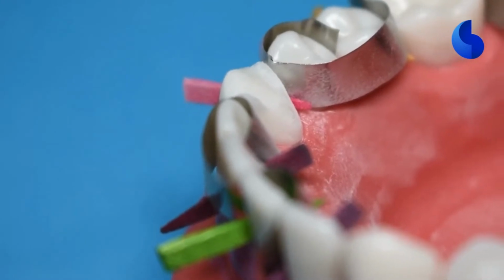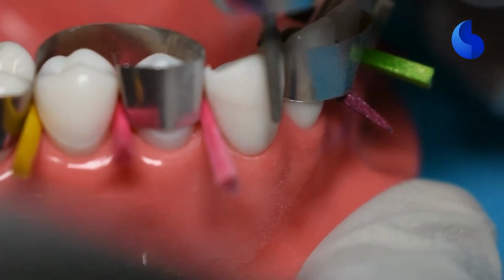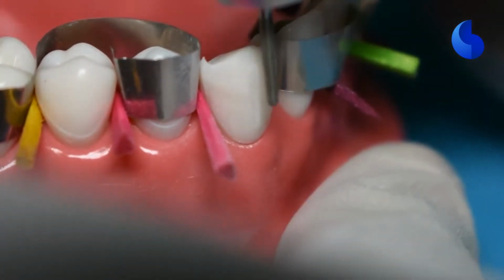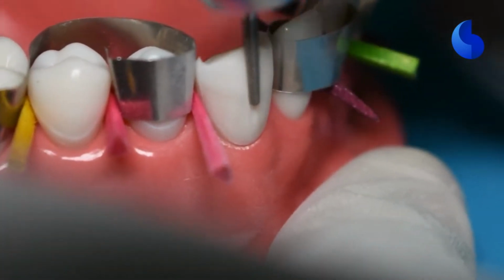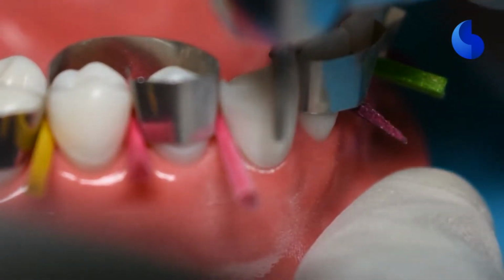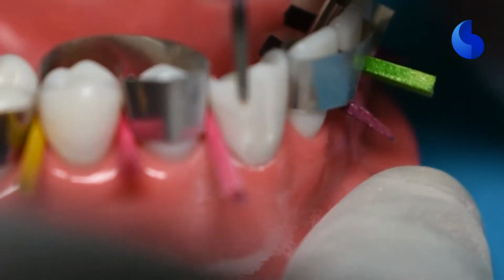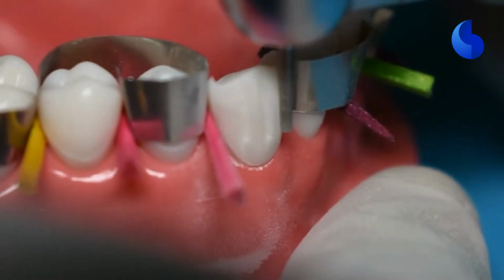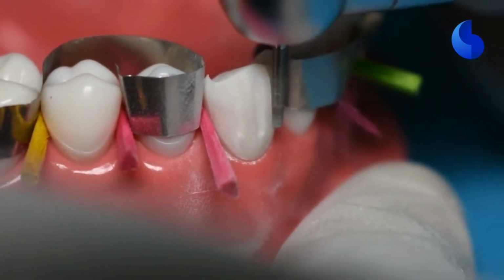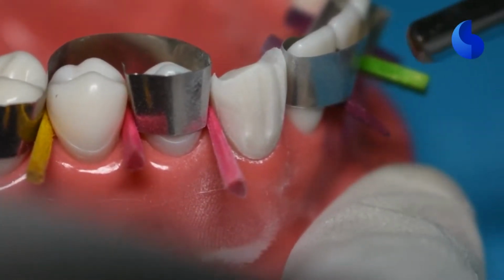Once you're happy with that, our next step is to move on to our facial reduction. So for the buccal surface, the clearance we are looking for is 1 millimeter of porcelain thickness. You can start with placing one depth groove in the middle of the facial wall. So the depth of this depth groove can be 0.8 millimeters, and then place another depth groove in the mesiofacial and the distofacial transitional line angles. These 3 depth grooves should give you enough orientation to reduce your facial surface.